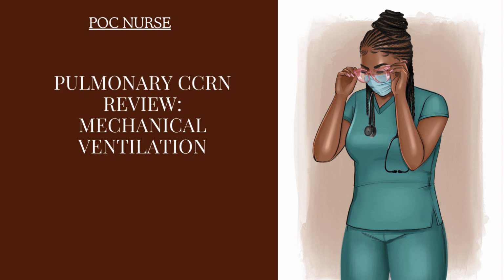The only volume the patient will get is the volume that the patient pulls himself or herself. So in this case, the patient is able to breathe on their own at some point during their respiratory cycle, and that could help them potentially get off the ventilator at a certain time.